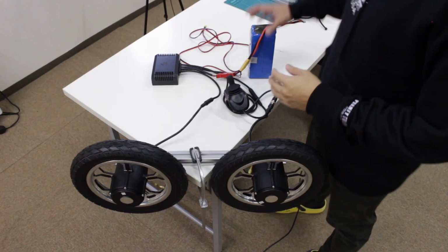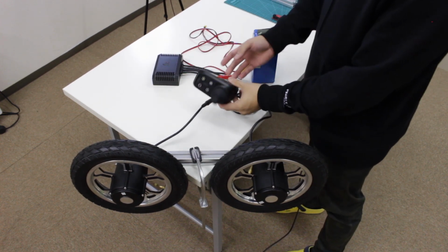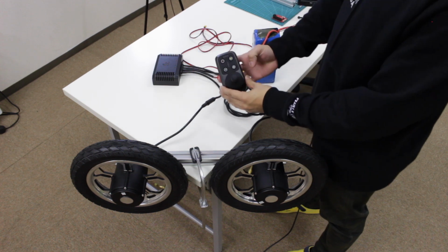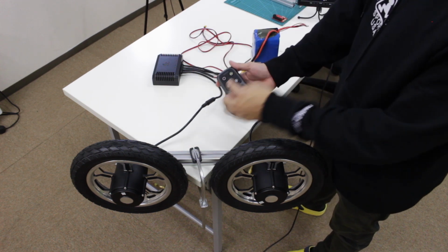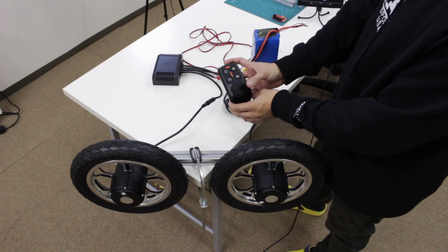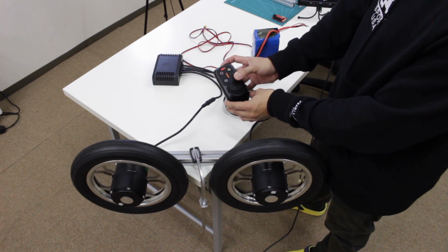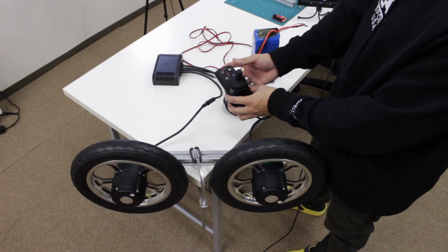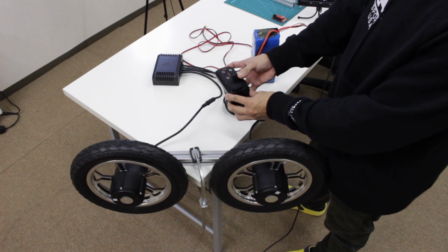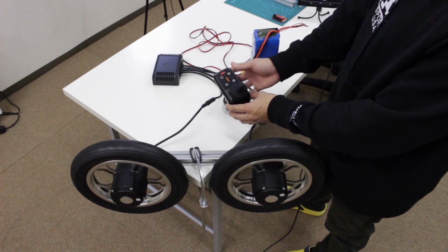Okay, so right now I plug the battery into the ESC, and both wheels and the joystick are also plugged in. We can turn the wheelchair on by just pressing this button. And yeah, there's some LED indicating. Press throttle and skid left, right, and also turn back as well. There's also a warning sound. And that is the default configuration for the wheelchair.